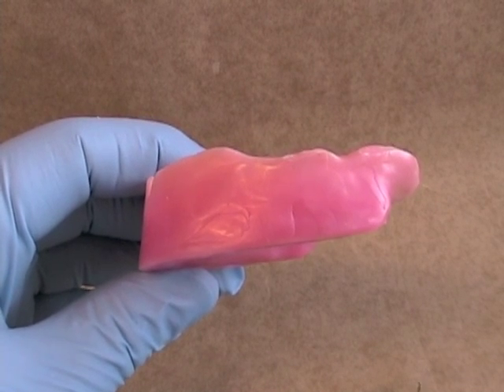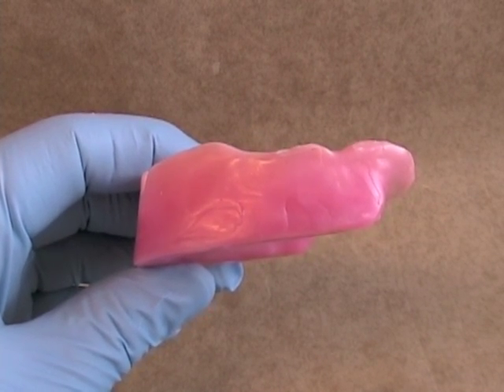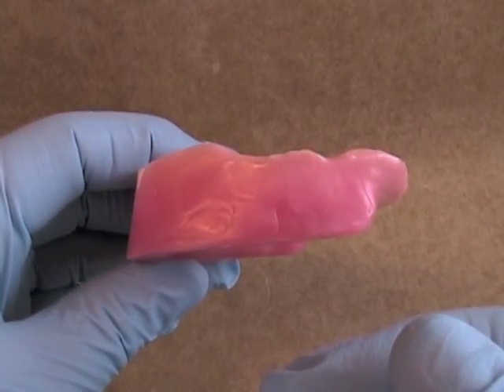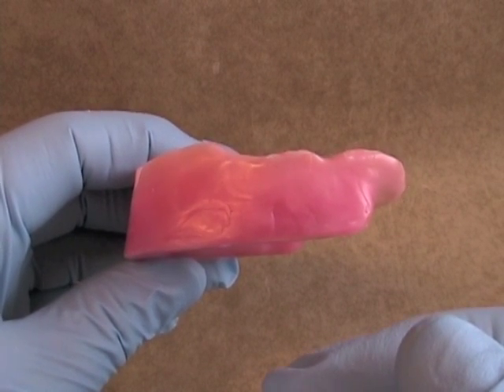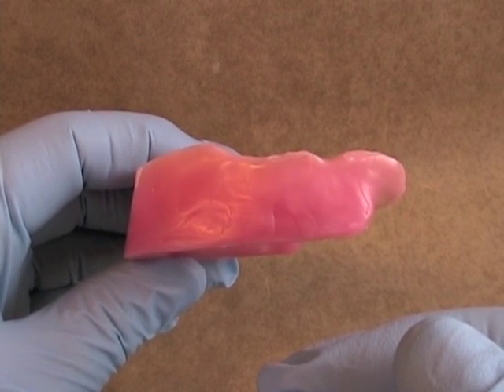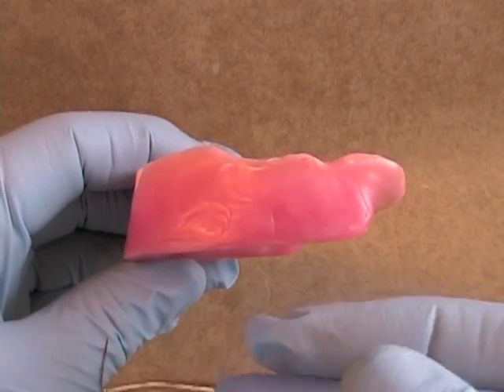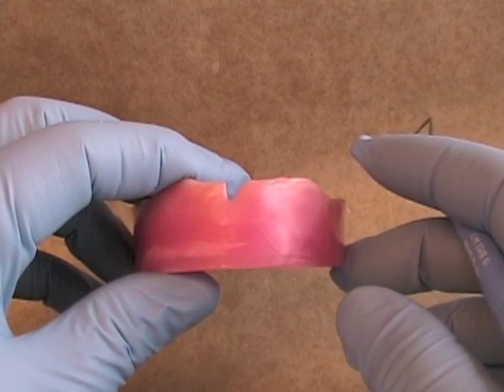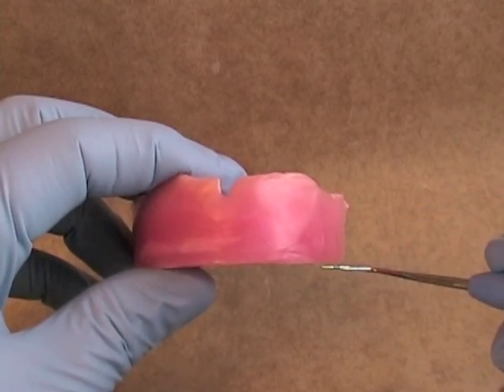When we place the maxillary rim intraorally, we expect to see a couple of things. First, the incisal edge of the rim should fall 1-2 millimeters below the upper lip when the patient is at rest. When the patient says the fricative sounds — the Fs and the Vs — the edge of the rim should just touch the wet line of the lower lip. Looking directly at the patient, the rim should be just visible below the lip.